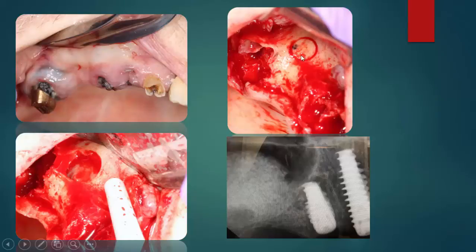مثل ما شايفين هون بالصورة الثانية عملنا الاكستراكشن وهون الاوتلاين للويندو، والصورة الثالثة تحت هون عم نشوف كيف عملنا الساينس ليفت، وبعدين حطينا الزراعات. هون الاكس راي بتوضح لي هلا مثل ما شايفين الدوم شيب راديو اوبيك.